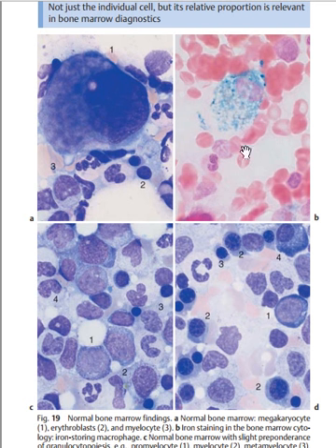Now the next one, in diagram B, is bone marrow staining. Is it clear? This staining is different. The staining here is not the same as the hematoxylin and eosin stain or the eosinophilic stain that we know has been used. In this case you use iron staining. These are iron-storing macrophages, where you use iron staining. Is it clear? Because it is going to show the iron-storing macrophages.